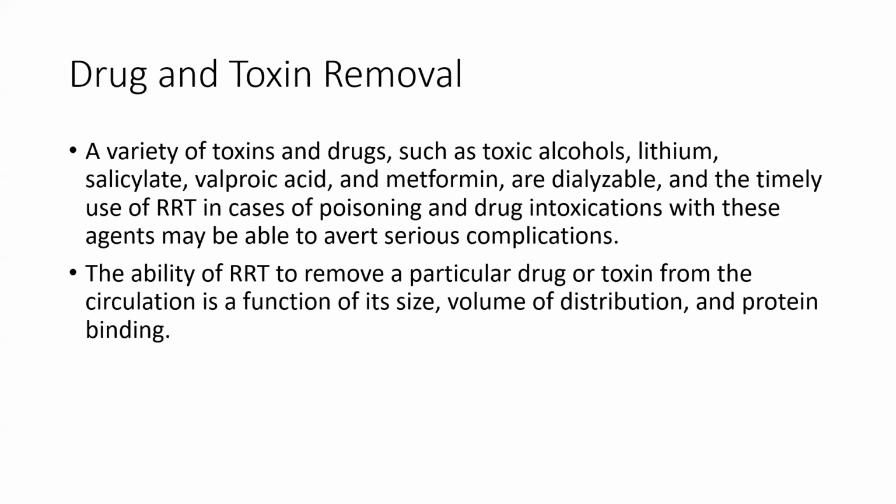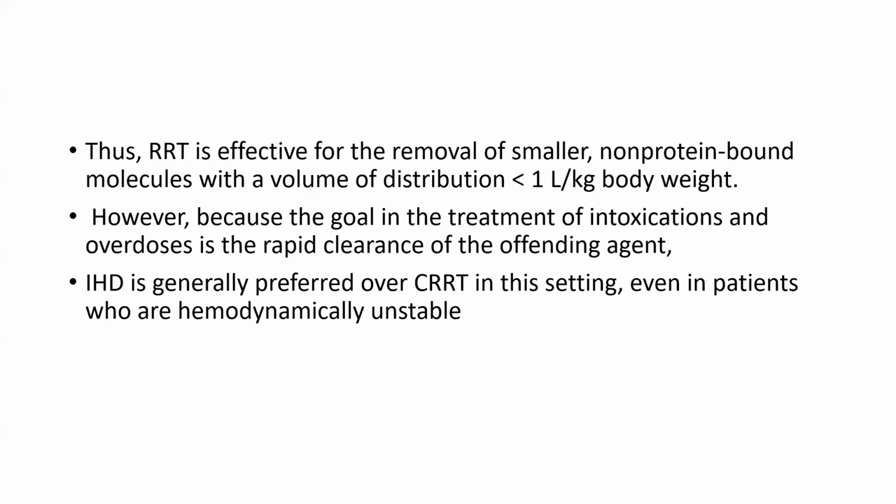The ability of RRT to remove a particular drug or toxin from circulation is a function of its size, volume of distribution, and protein binding. Thus, RRT is effective for the removal of smaller non-protein bound molecules with volume of distribution less than 1 liter per kg of body weight. However, because the goal in the treatment of intoxication and overdoses is the rapid clearance of the offending agent, IHD is preferred over CRRT in this setting, even in patients who are hemodynamically unstable.